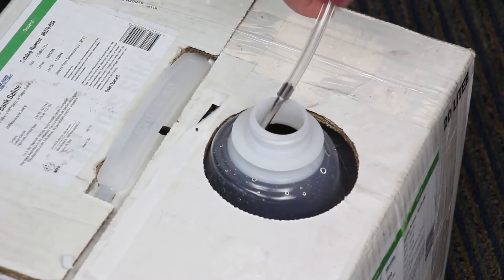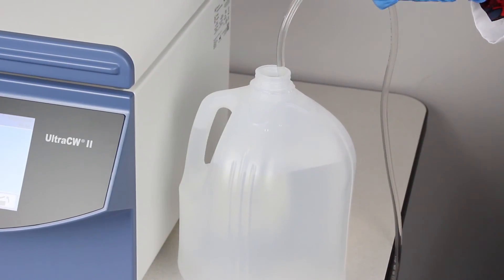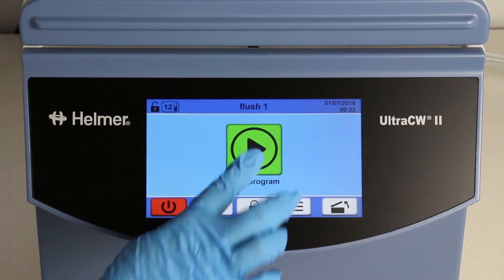Then, remove the saline tube from the saline solution container and place it in the container with deionized or distilled water. Select and run the FLUSH-1 program.